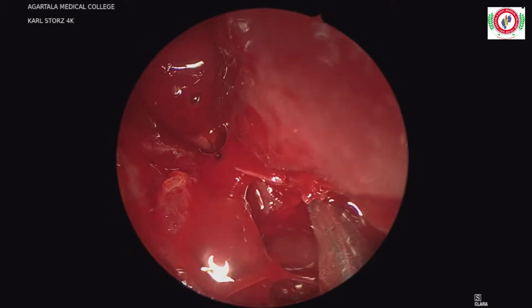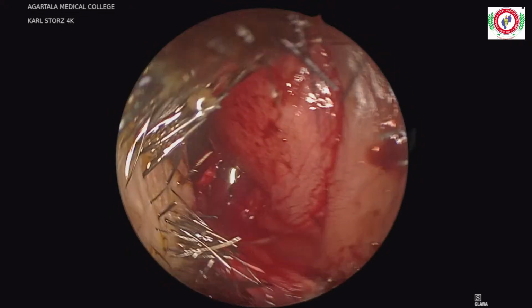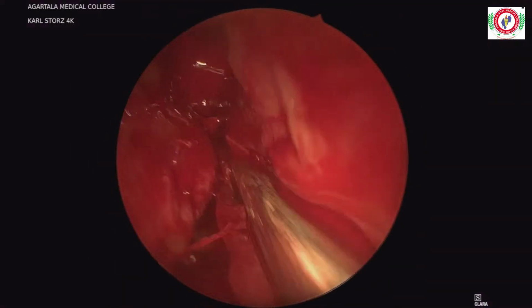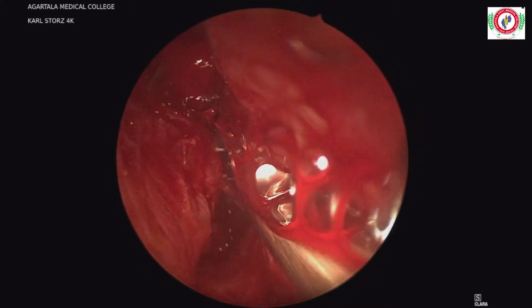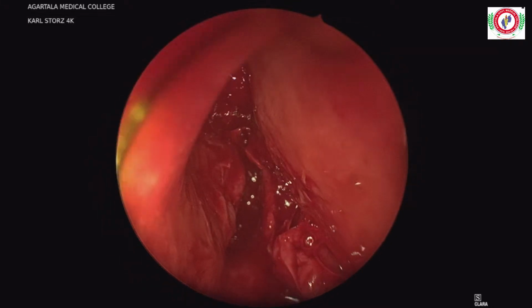Give me clear suction. Yeah. So that's the spur. Okay, give me a suction elevator now.